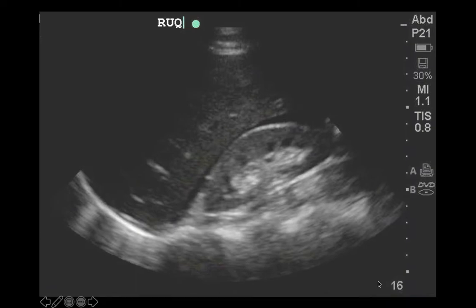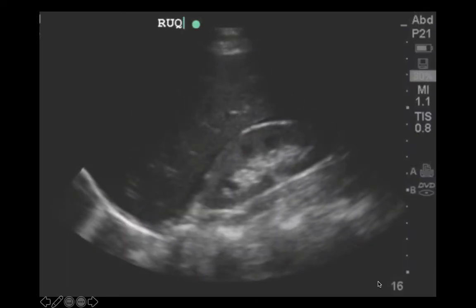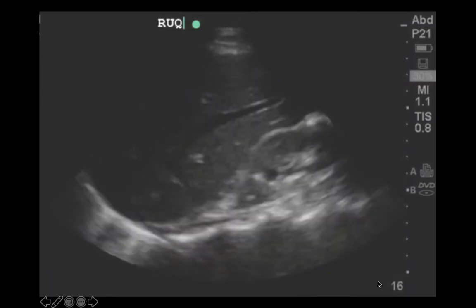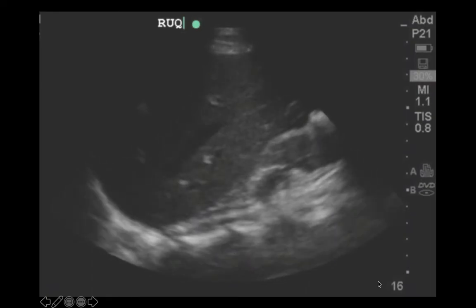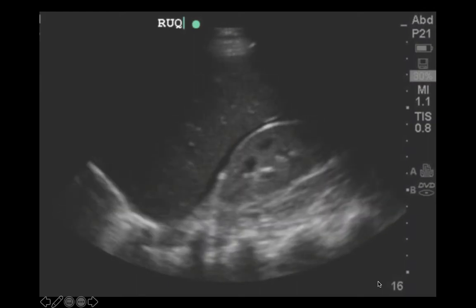So take a look at this video. You can see on the left side of the screen is the patient's head, the right side of the screen is the patient's feet, our liver is visualized here in the center, and then our kidney, and right in between them we see that black stripe of free fluid. This is a positive right upper quadrant.